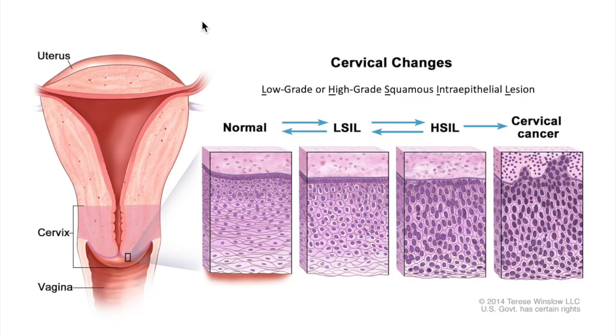So the PAP smear is a routine diagnostic test to determine if a woman is at risk of having cervical cancer or has cervical cancer. By swabbing the tissue and viewing it under a microscope, pathologists can see whether the cells are normal in terms of the shape of their nuclei and their cell edges, or whether or not they're cancerous. But pathologists can also see whether the cells are not completely normal but not yet concerning regarding cancer, or if they have progressed to a stage suggesting that they are at high risk of getting cancer.